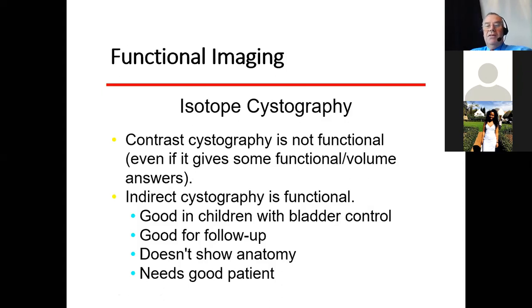I'm going to talk a little bit about cystography. Now, contrast cystography, again, is not functional, but can give you some idea of reflux, and is used particularly in boys, because again, boys, you can use a bit of lead shielding and you can avoid radiating their tender bits. Girls, it doesn't make a lot of difference. It's difficult to lead shield because you don't know where the ovaries are. So we do try to do direct cystography in young girls. And I'll describe that when we do our pediatrics.